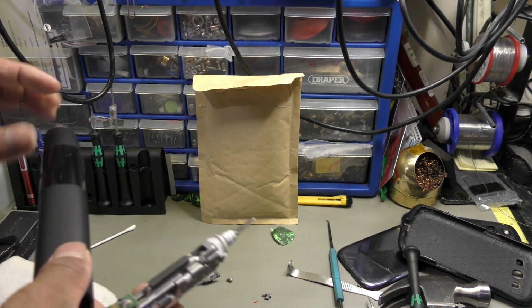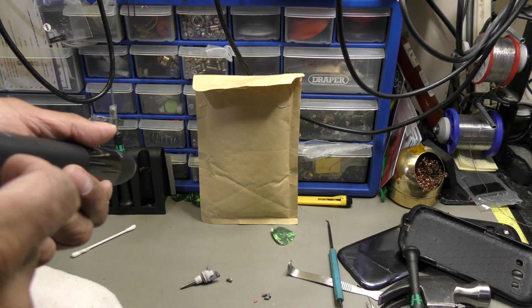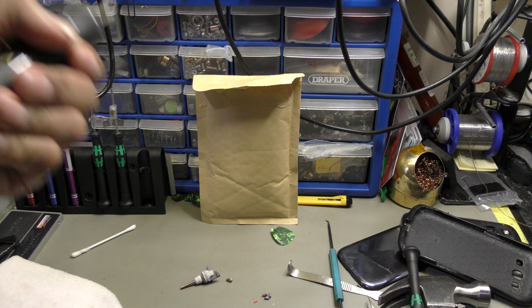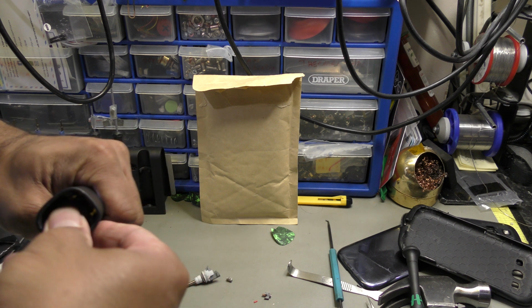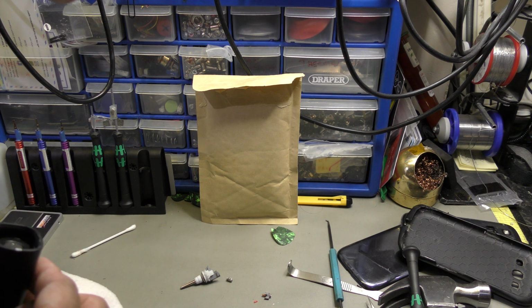Now what I'm going to do is reverse the process. And just clip it back in. Done. It's just press it back in, you know, and you're happy days. And those little clips have gone back in their place.